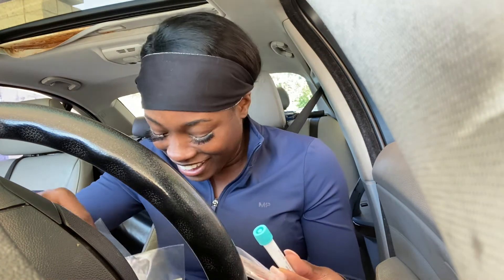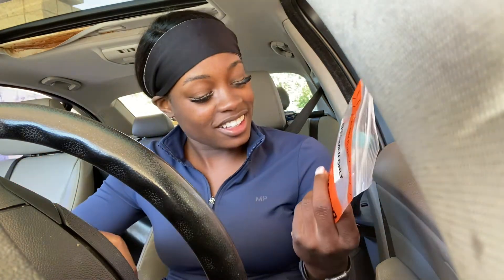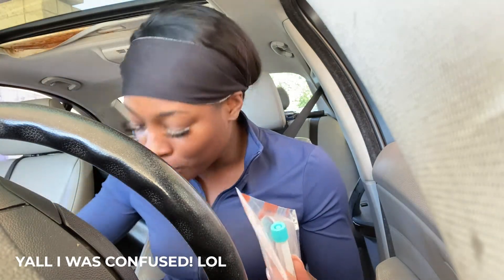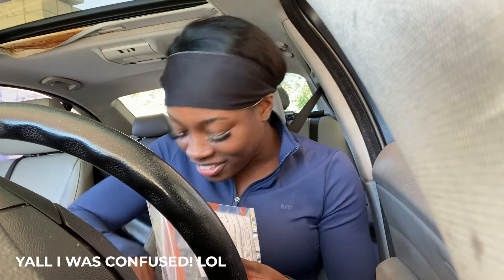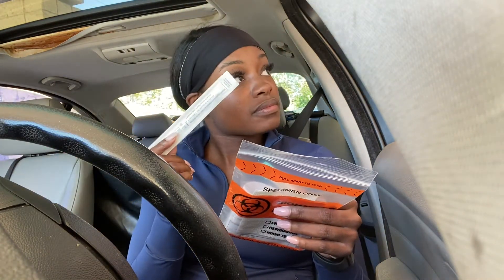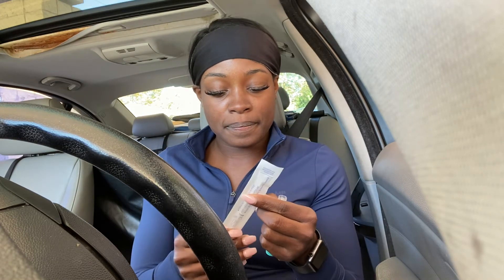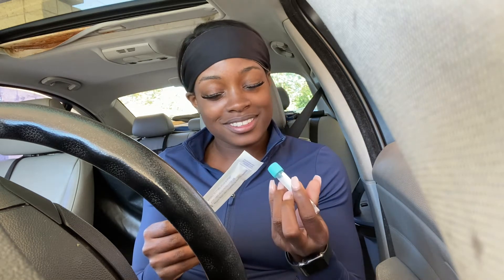In where? In the bag — you put it on the back. You need a brown bag. It was hiding from me. This is going to be a white stuff. See, I'm going to put those three cards on it. So once you're going to swab, you're going to have to put it in the vial and break it off in the vial. That's the hardest part.